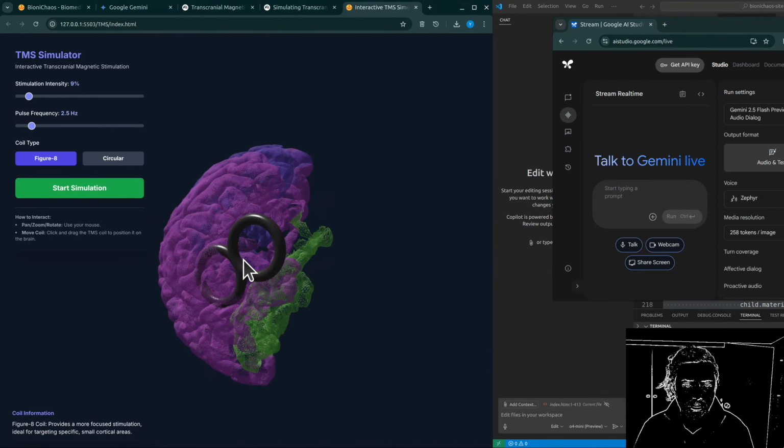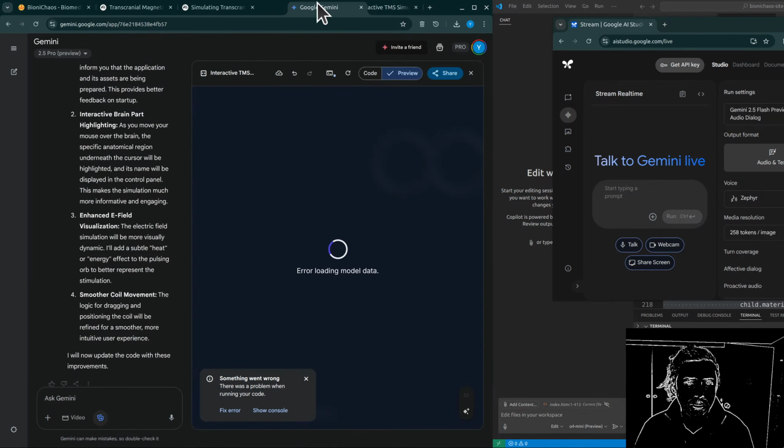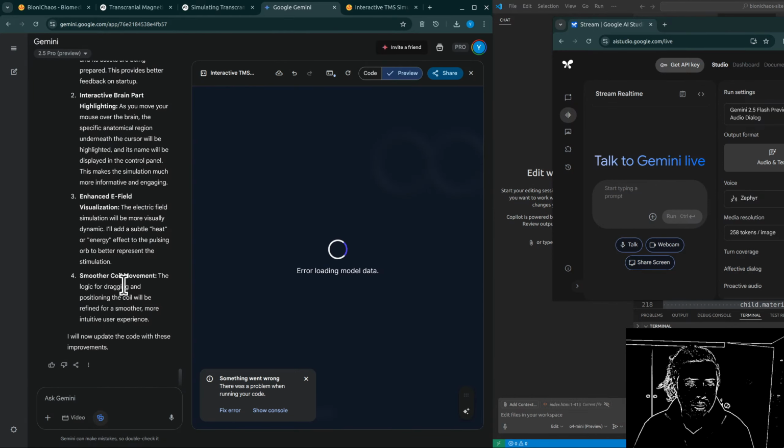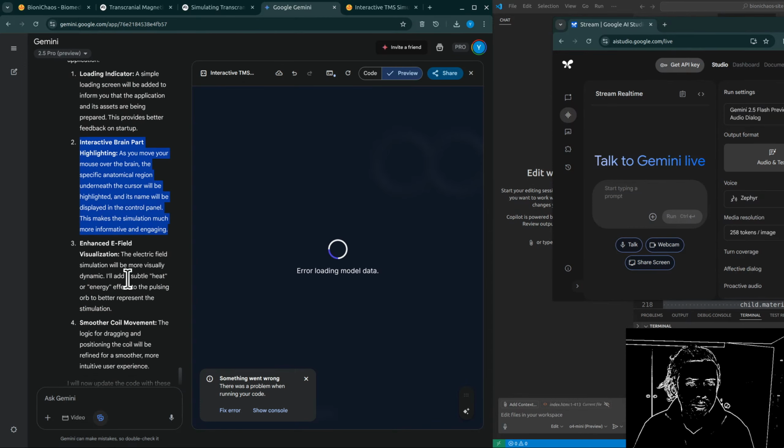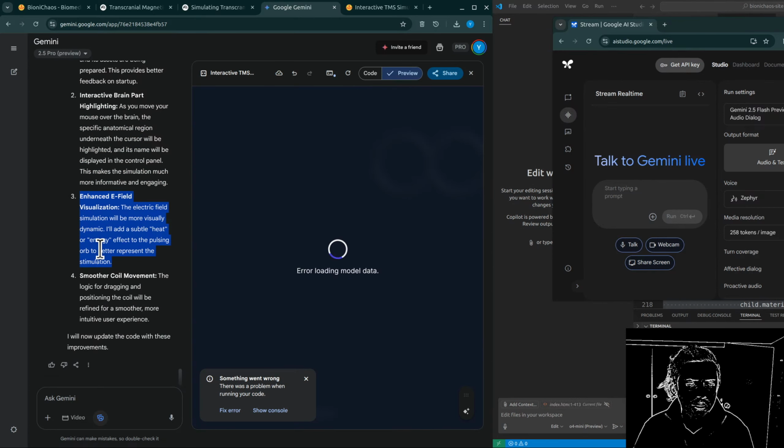The material really emphasizes that simulating TMS is this powerful integration. You've got medical imaging for the anatomy, you've got physics for the electromagnetics, and you've got computational neuroscience for the neural responses. Bringing it all together. Exactly. And by bringing these fields together through simulation, researchers are gaining, well, really unprecedented insights into exactly how TMS interacts with an individual's brain. And the ultimate goal? The ultimate goal, as highlighted again and again, is using these insights to pave the way for more effective and crucially more personalized treatments for a whole range of neurological and psychiatric conditions.